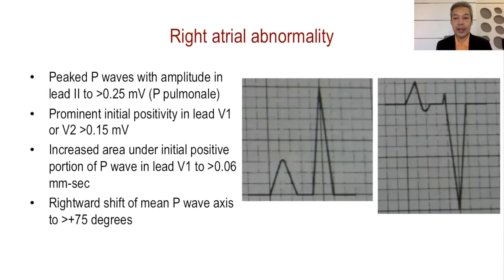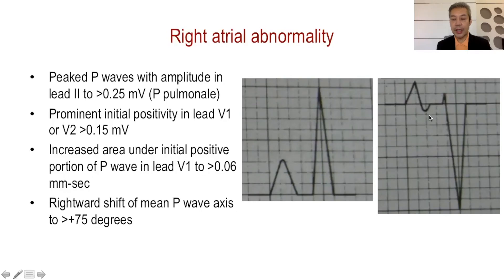Right atrial abnormality is different because instead of making the P wave wider, it becomes taller. Again, look at lead 2 and lead V1. There is peaking of the P waves, which should normally be less than 2.5 small squares. In right atrial abnormality it is more than that — this is P pulmonale or a peaked P wave in lead 2. If you look at lead V1, it is the initial part of the P wave that is affected and the terminal part is normal. The area under the initial deflection is greater than 0.06, and there is a rightward shift of the axis.